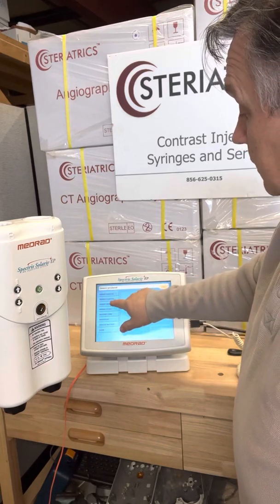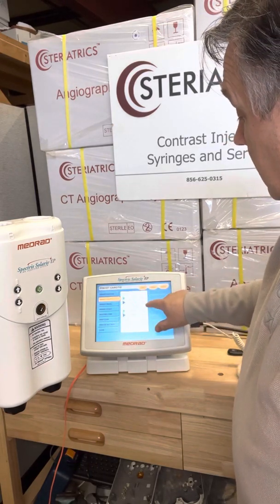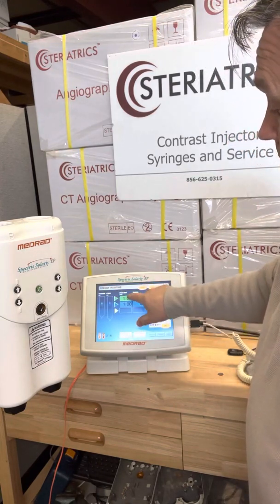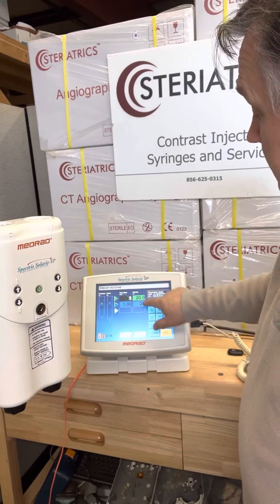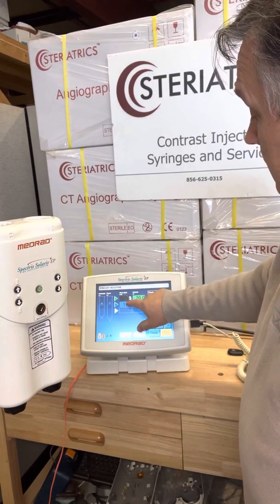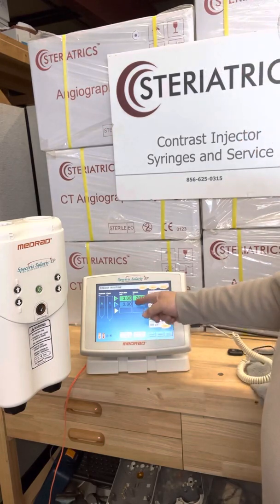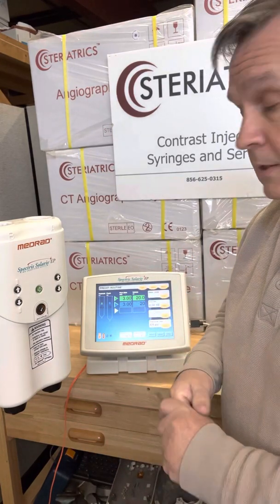If we want to just do a regular, there's a preset carotid. But let's just go to this screen, which is routine. I actually like 3 mLs a second — this is for 20. Go over here at 3 mLs a second, hit enter. And now we have 3 for 20 and 3 for 20, just to show you how to operate this.